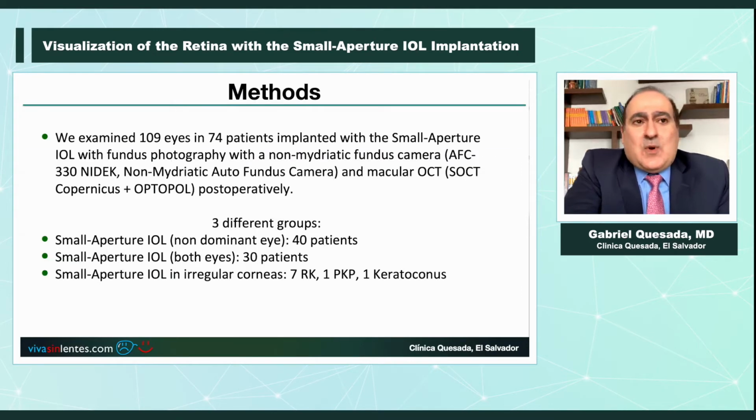We examined 109 eyes of 74 patients. We used a fundus camera photography, the Nidec non-mydriatic, and the macular OCT SOCT Copernicus from Optopol.